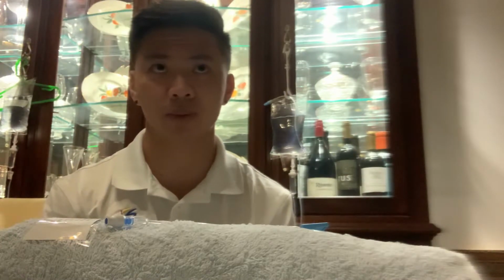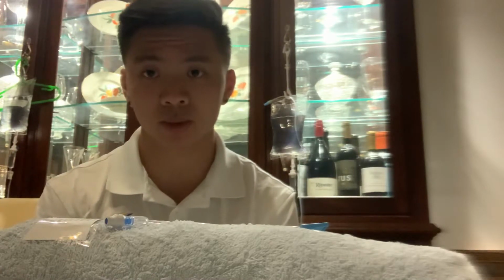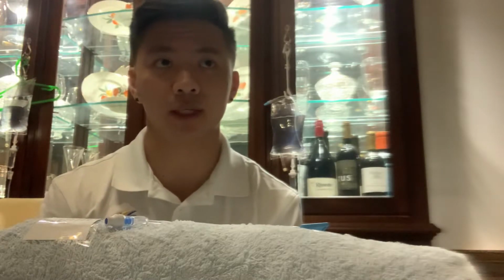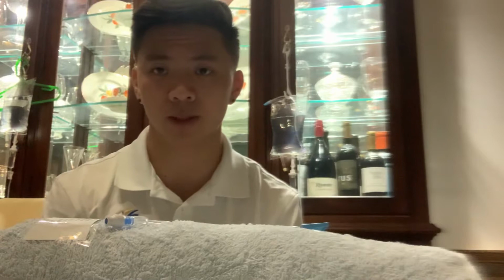After filling it up, I'm going to go ahead and prime the IV tubing. After I prime it, make sure it's closed again, clamped. I'm going to go ahead and make sure there's no air bubbles after I prime it. If there's any air bubbles, I'll just flick the tubing to mobilize the air bubbles and make it go through the drip chamber and out of the primary IV tubing.